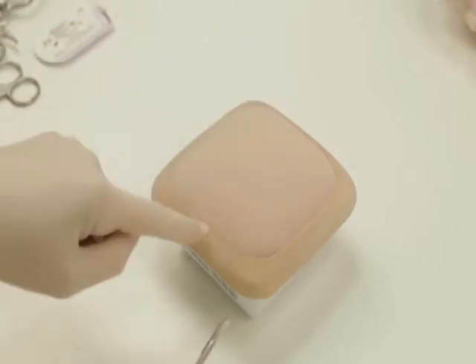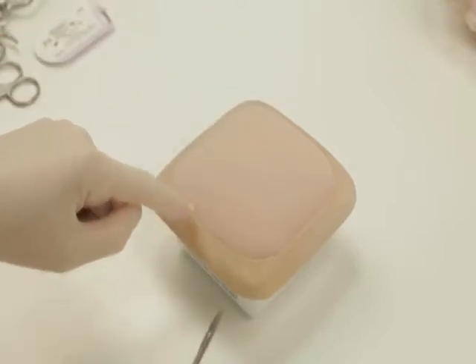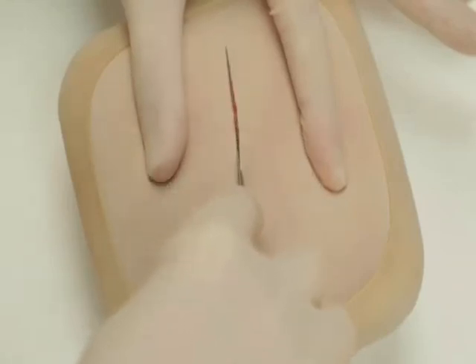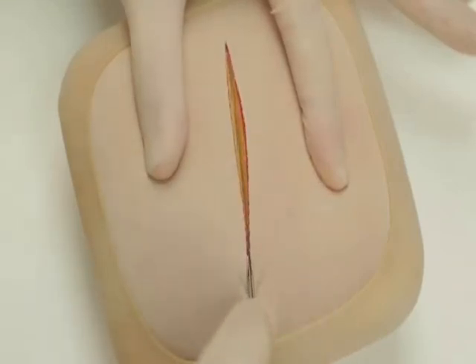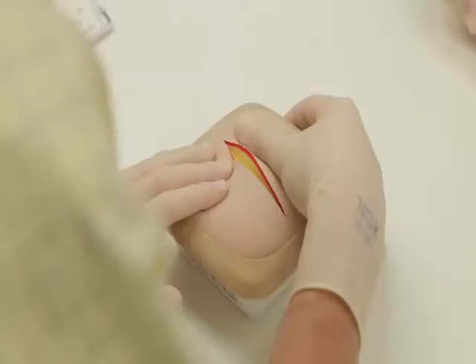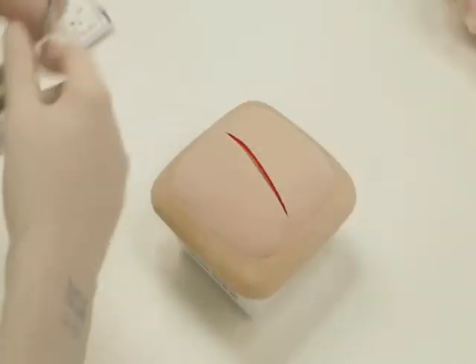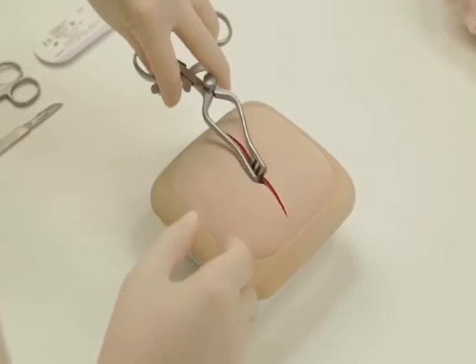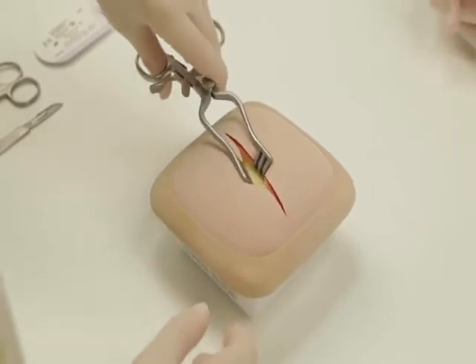In this open appendectomy model, a Lanz incision is performed. The skin is incised with the belly of the knife. Next, divide subcutaneous fat, Scarpa's fascia and underlying tissue to expose the external oblique aponeurosis.